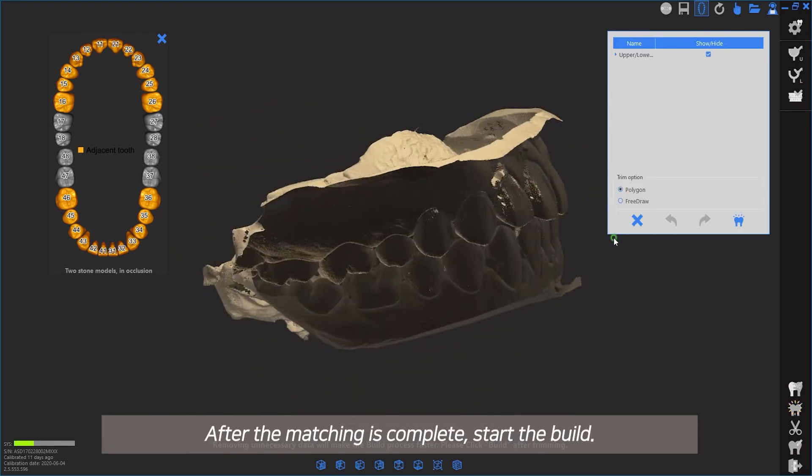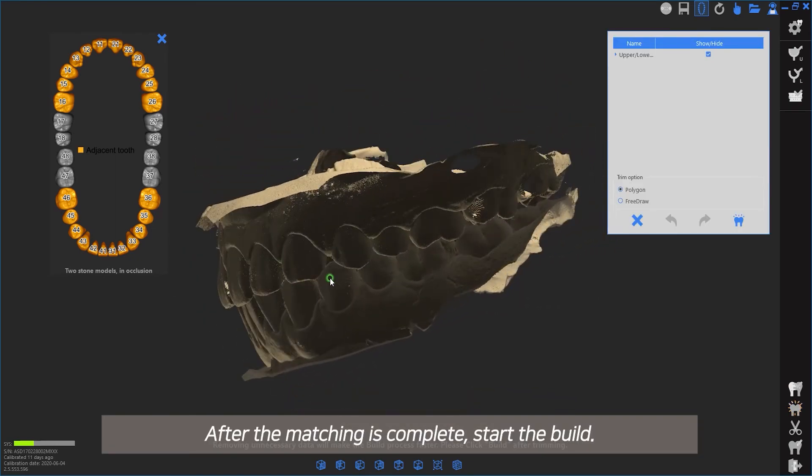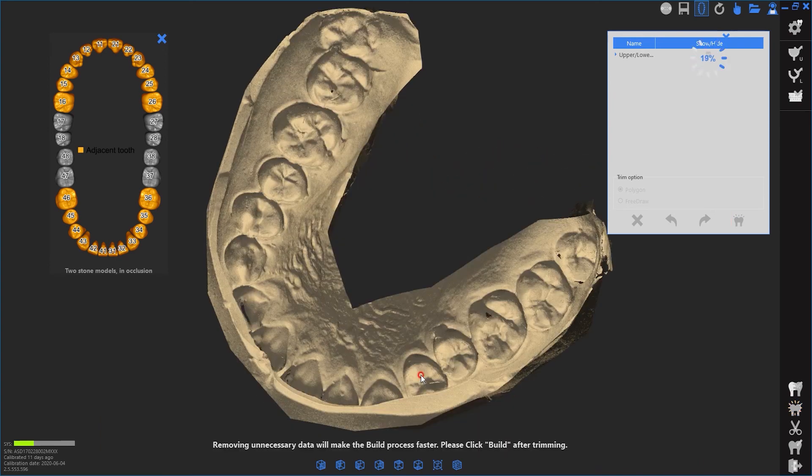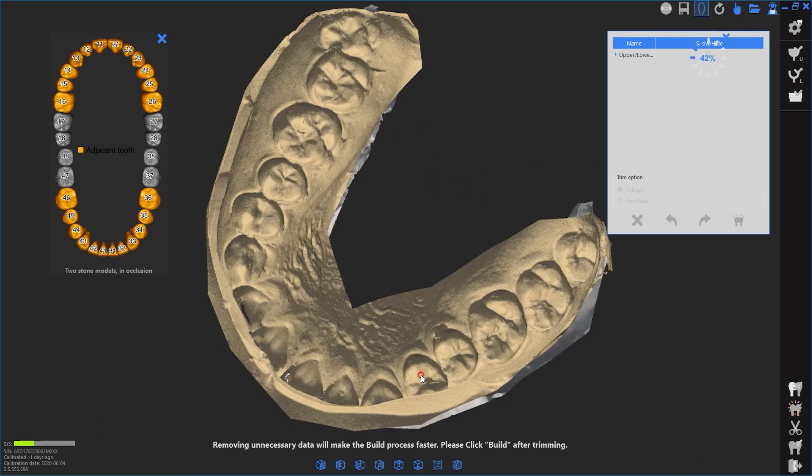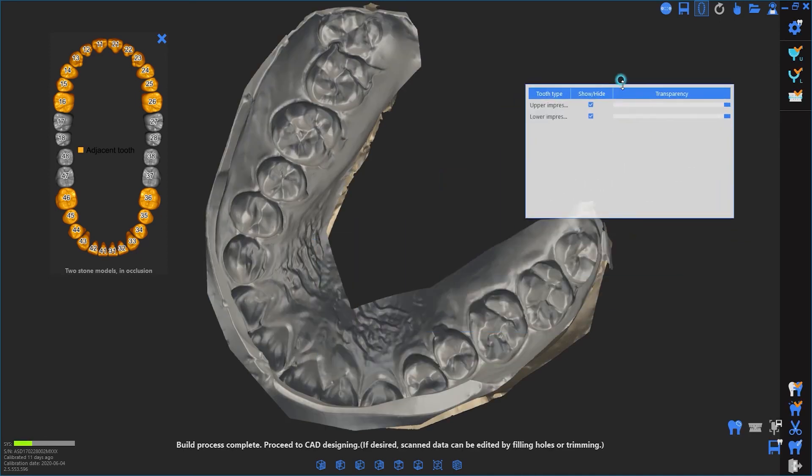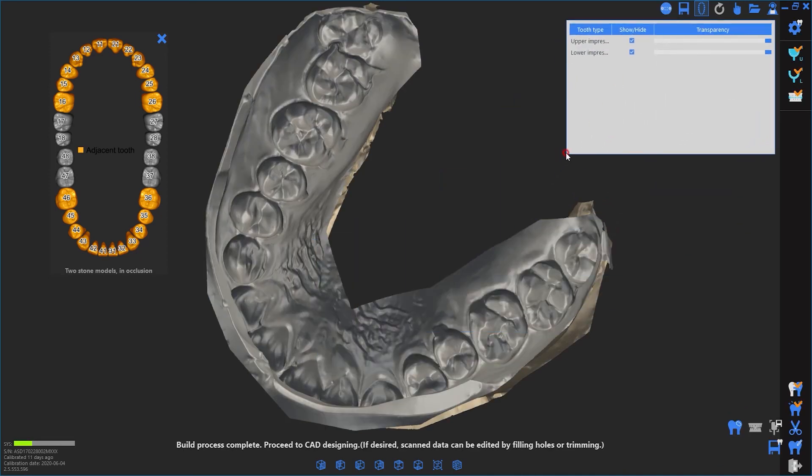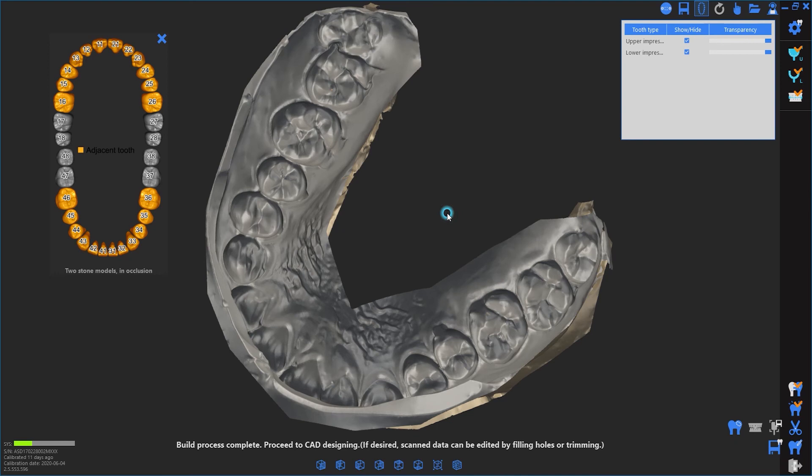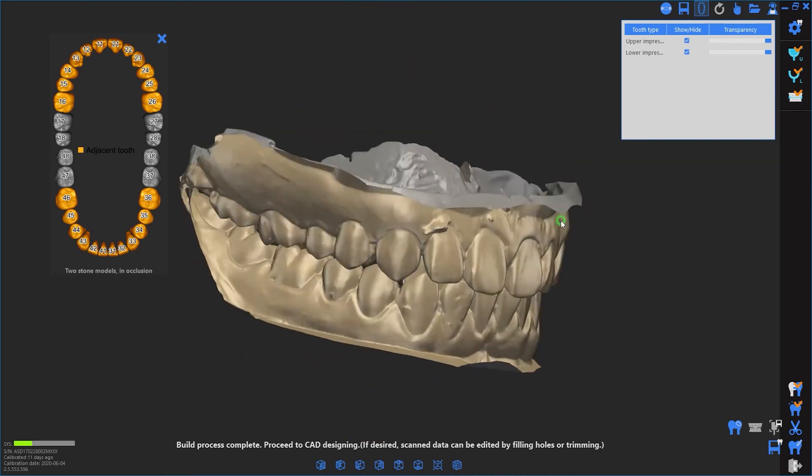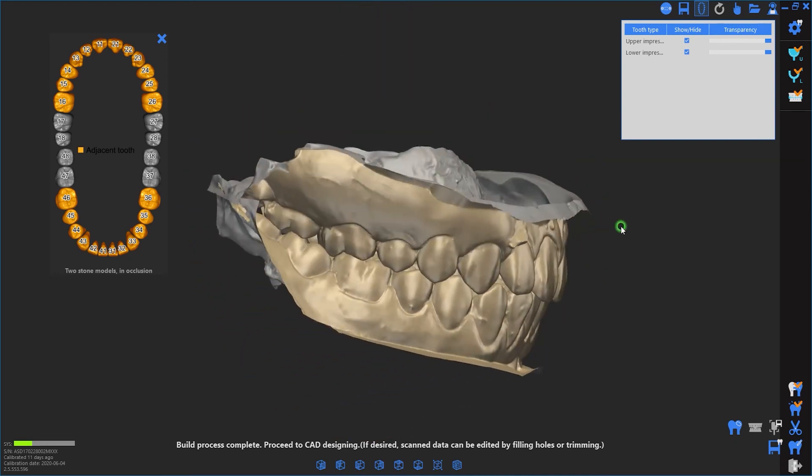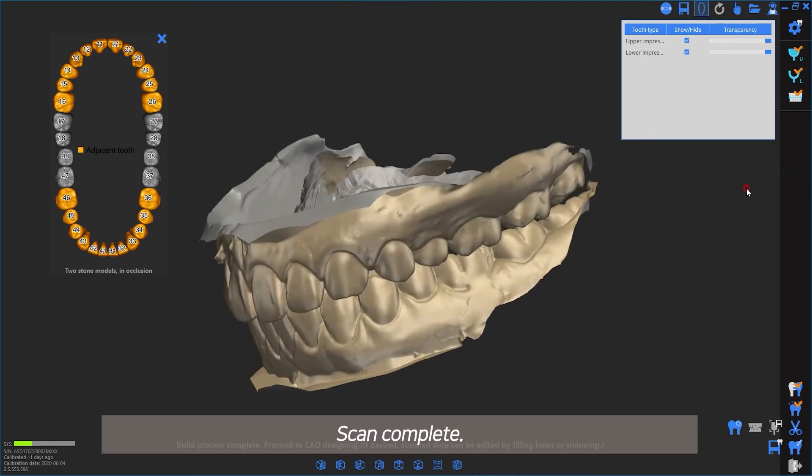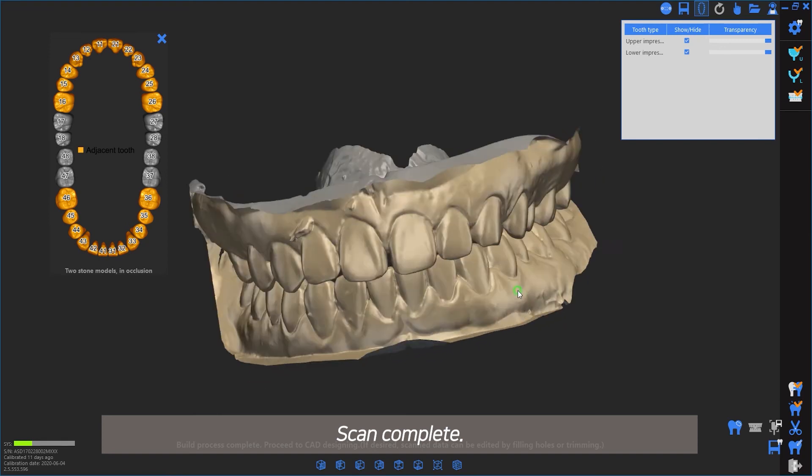After the matching is complete, start the build. Scan complete.